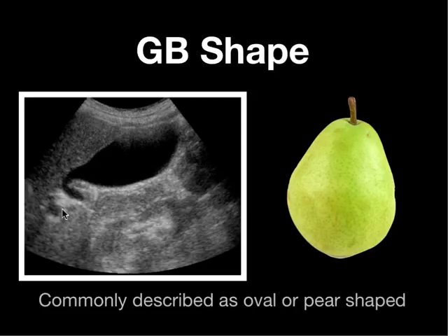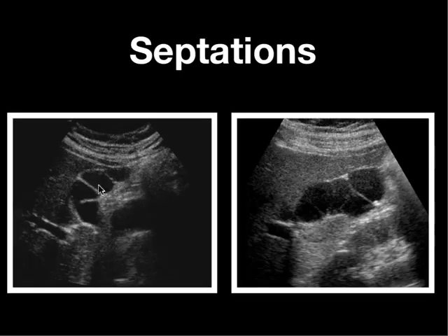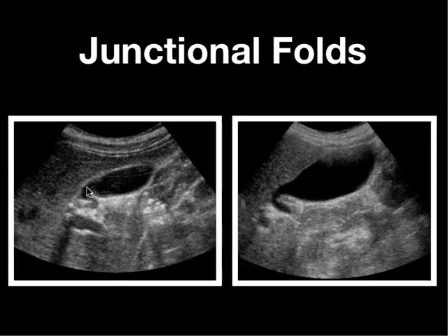Ideally, the gallbladder has been described as being oval or pear-shaped, but there's going to be a lot of variation to the shape of the gallbladder. Here are examples of phrygian caps — these are folds in the fundus of the gallbladder. On these sagittal views you can see the fold in the fundus, called a phrygian cap. Although not very common, here you've got a gallbladder with multiple septations, which theoretically poses an increased risk for gallstone development. Here are also examples of junctional folds by the neck, which are actually very common.